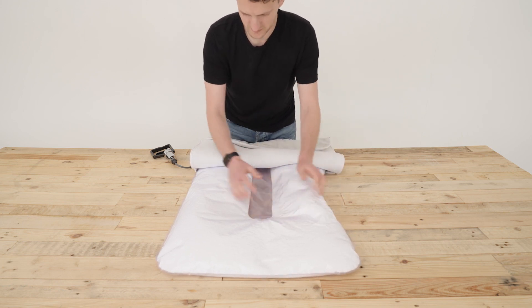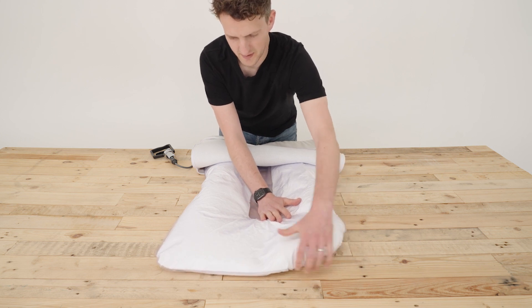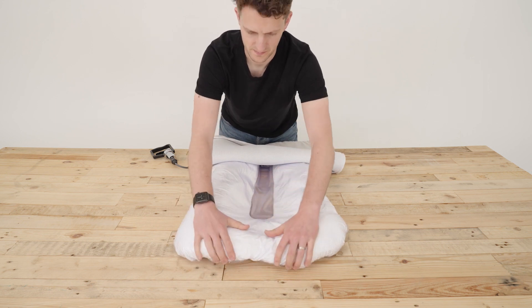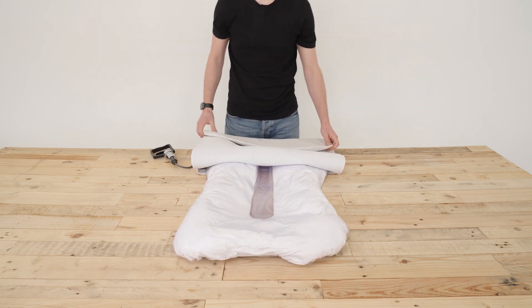Manipulate and tuck the Neo to achieve the desired shape. The edges can be rolled under to help reduce the overall size. Before each session, the pump should be used to vacuum the base cushion to the desired level of firmness.